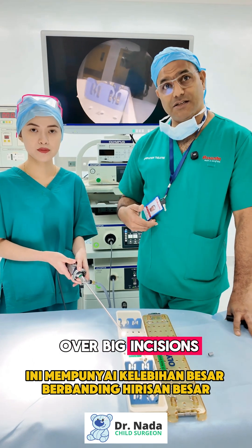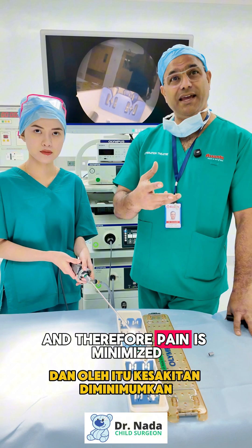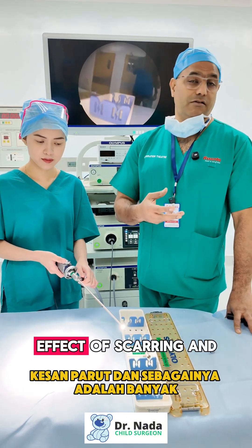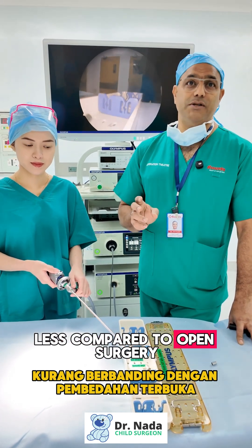This has big advantages over large incisions. The trauma to the body and therefore pain is minimized, the recovery is much faster, and the long-term effects of scarring are much less compared to open surgery.